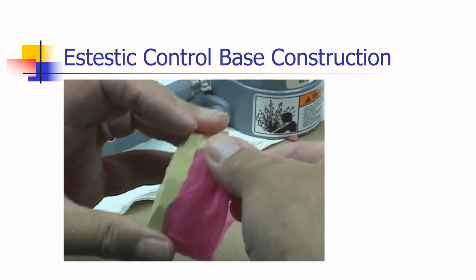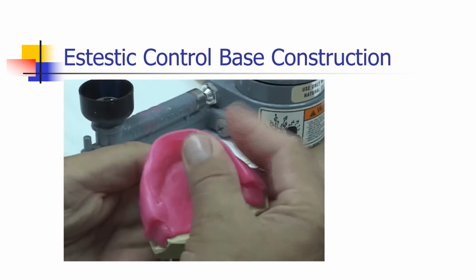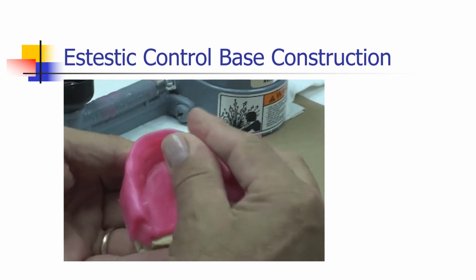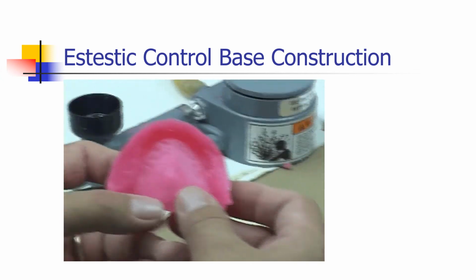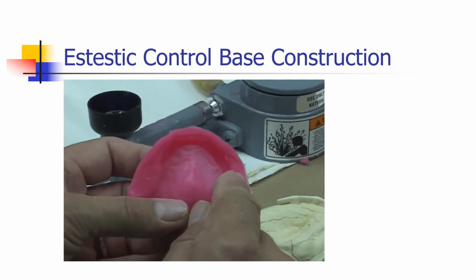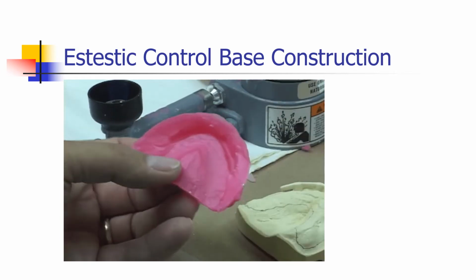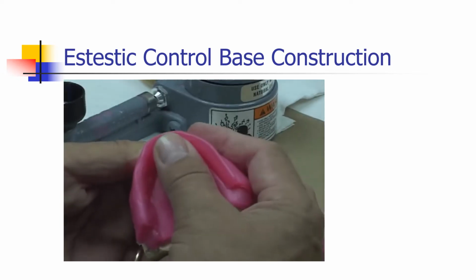I'm kneading this and making the base a little bit thicker. I'm shaping along. What I want to do now is pull this off. If you use a wet model, it comes off very nicely, nice and easy. Then we're going to look down and try to get the periphery of your esthetic control base to go right where the line is that we drew on the model, or into the mucobuccal fold. See, we're a little bit short on this right now, so I'm going to put it on the model, and then we're going to push it out a little bit around.